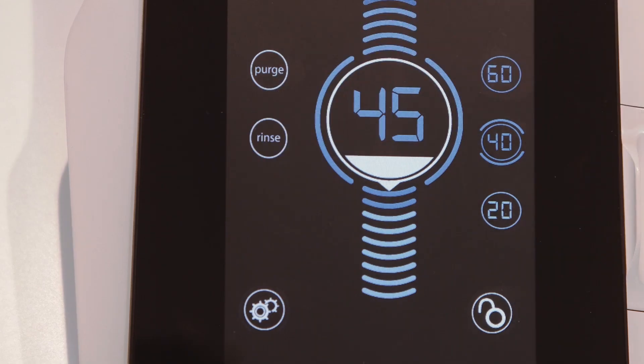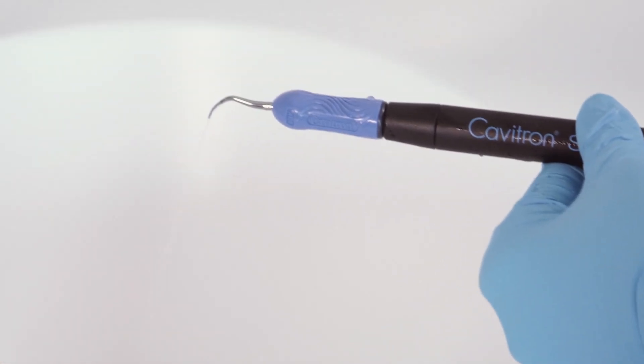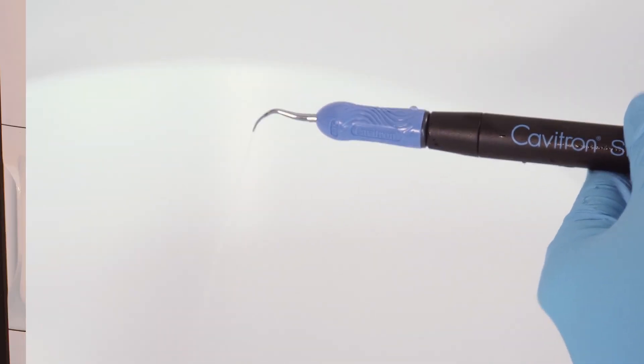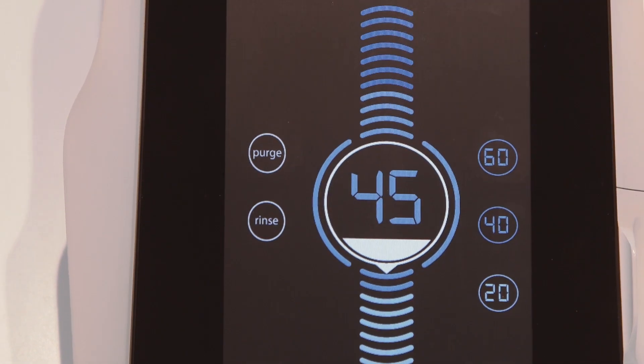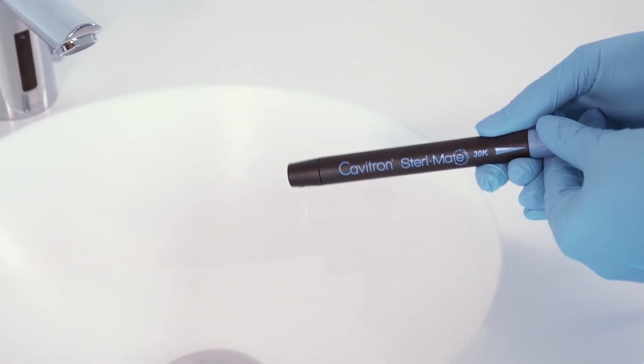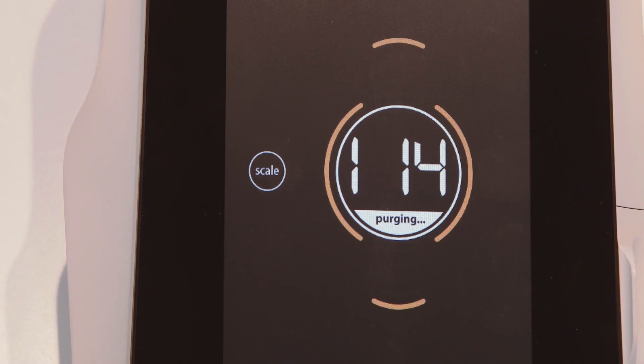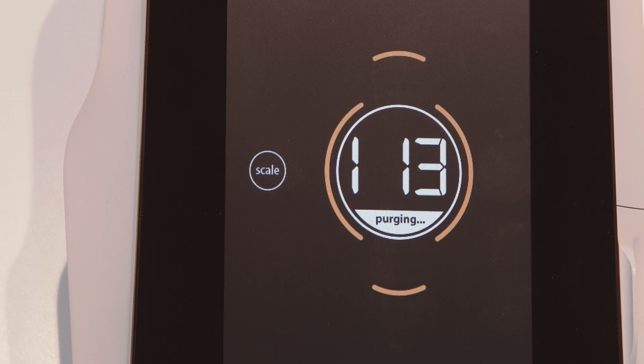The rinse icon is tapped to allow use of the handpiece for lavage only, without cavitation of the insert tip. The purge icon is tapped to access the feature which activates continuous water flow through the handpiece without an insert, for 120 seconds which is the suggested time to purge the water lines at the beginning of the day.